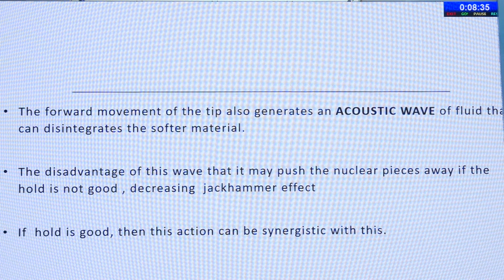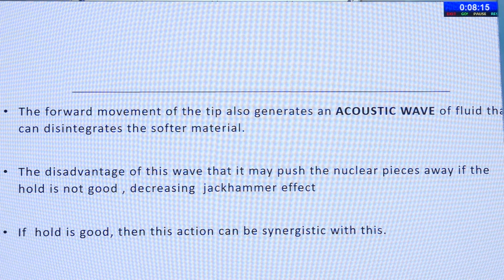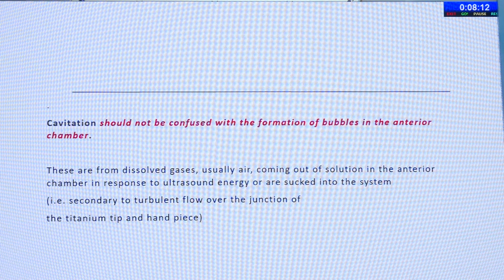Now the forward movement of the tip also gives an acoustic wave. So like in the jackhammer effect, it pushes the nucleus away. So if your vacuum buildup is not good, it will actually go against the jackhammer effect and the nucleus piece will be pushed away. But if your hold is good, then it will also affect the jackhammer effect. So we have to really look at the vacuum in every stage of phaco emulsification that we do.